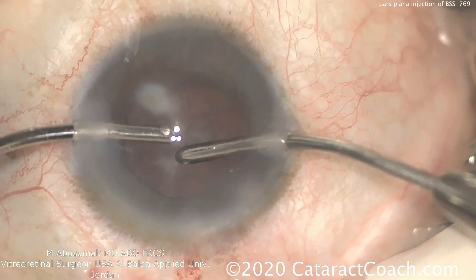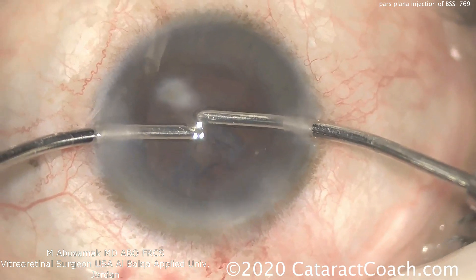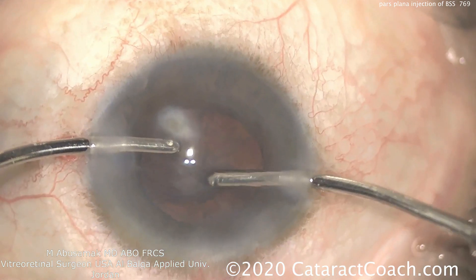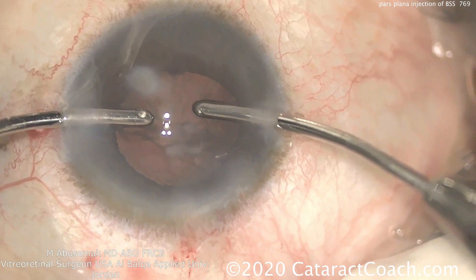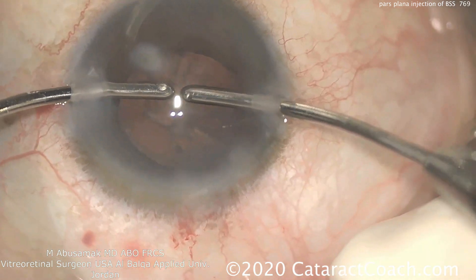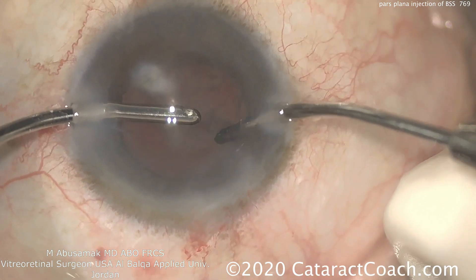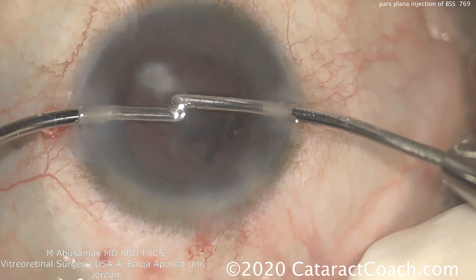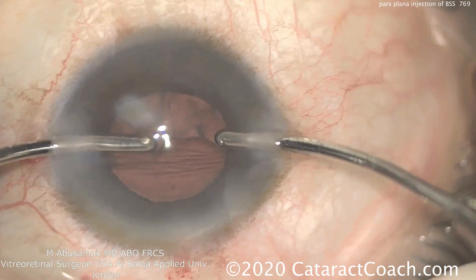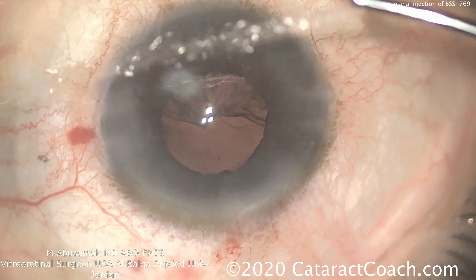For a monocular patient like this, would you do anything differently? Well, do your usual excellent surgery. With a monocular patient, if you have any leak in the incision — certainly for any eye, monocular or not — put a suture in. But you don't have to do anything differently because your normal technique already accounts for everything. You're already keeping the eye absolutely watertight and maintaining a clean, sterile environment.